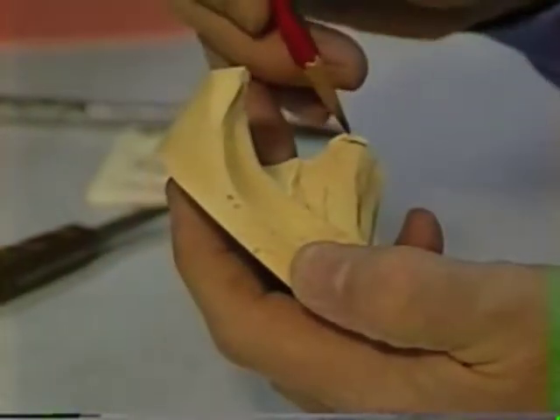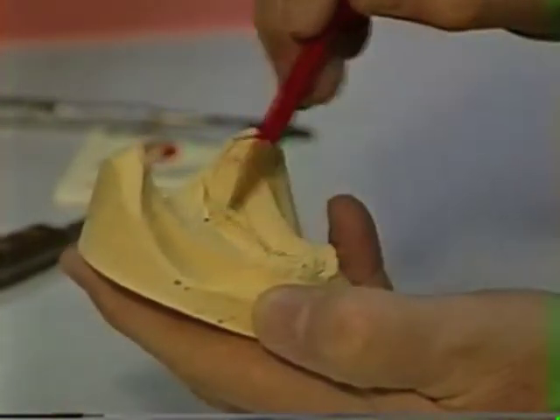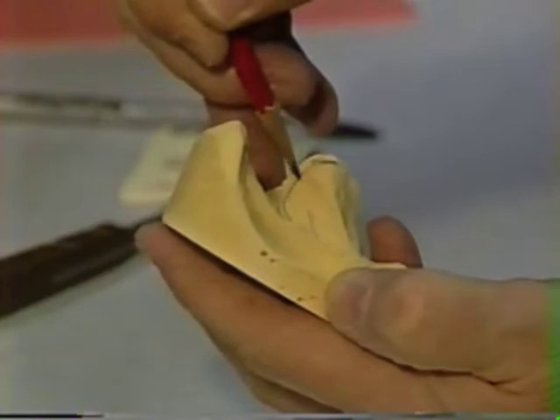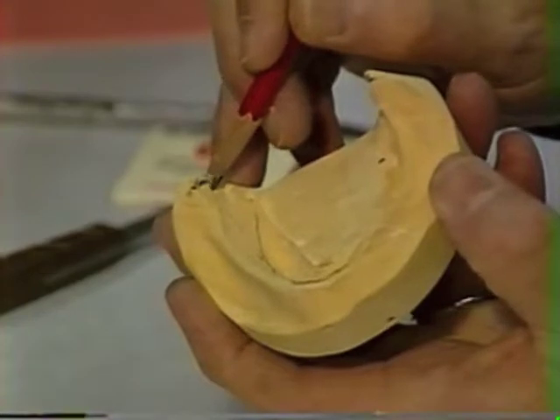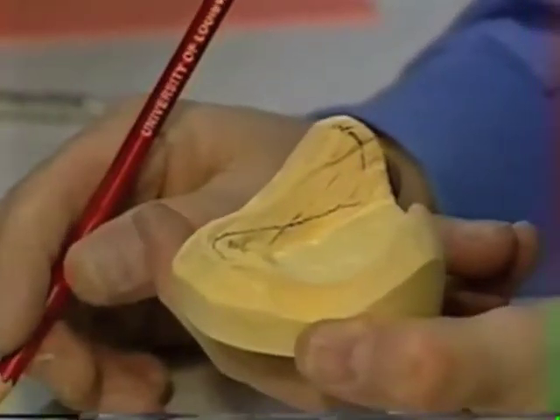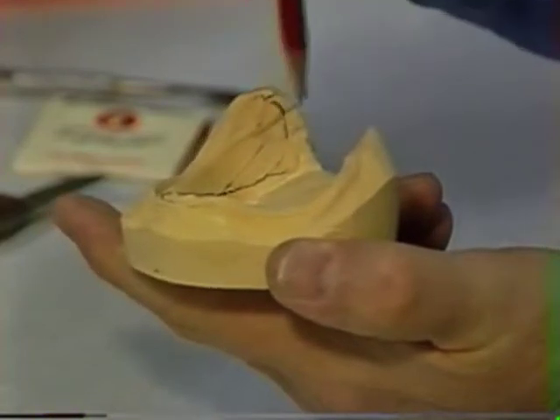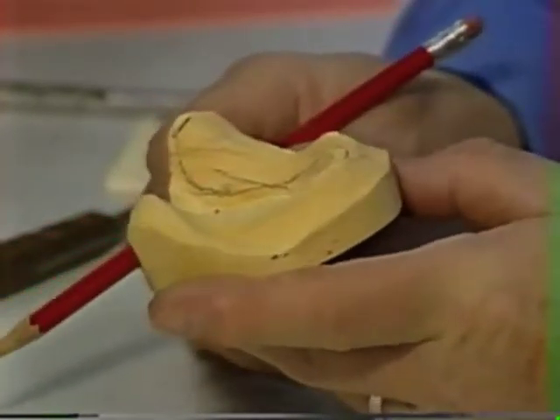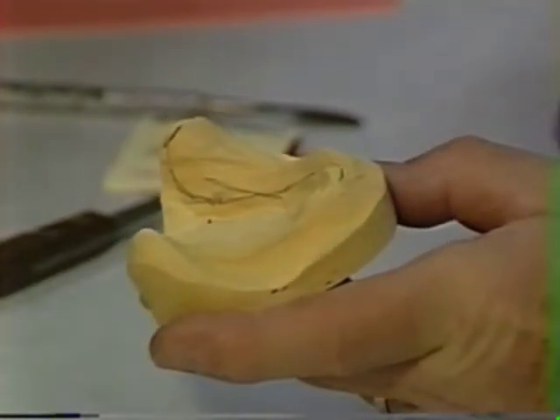Now what you want to do is to drop a vertical from the distal of the retromolar pad and let it gently round into this line that we had as a plane for the lingual flange here. So we let these just gently round into each other, and that's our form now for the lingual flange. The same thing on the other side. Drop the vertical from the distal of the retromolar pad and just let it gently round into it in such a manner. That will create for you now a tray that's going to extend in this area into an area on each side that is known as the retromylohyoid fossa area. And it's important that our tray extend to the proper depth into that retromylohyoid fossa area.